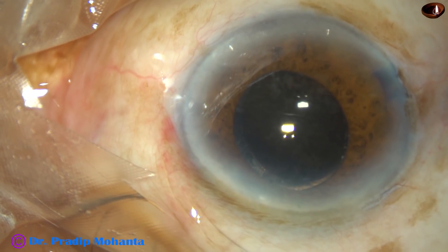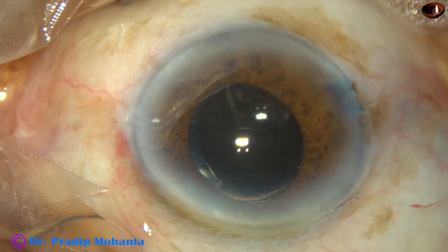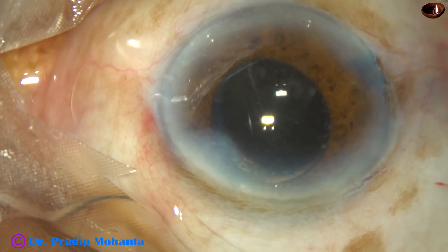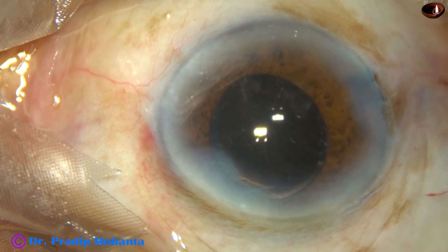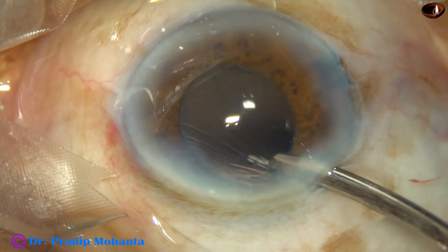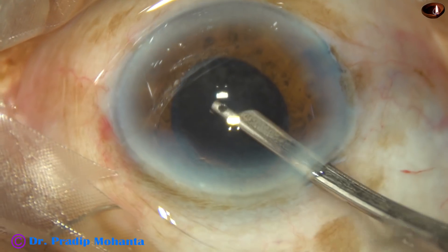This has been a very satisfactory surgery — a one-eyed patient with such a hard cataract, and I have been able to do phacoemulsification for this case. This is a bit of moxifloxacin. I use BSS to hydrate the corneal stroma on either side of the side ports so that these stab wounds close and become watertight. And now, this is the time for the final lavage of the anterior chamber. I always do this and I get very good postoperative results. I don't have any TASS — Toxic Anterior Segment Syndrome — in the past 10 years, because I strongly believe it is because of this final lavage of the anterior chamber.